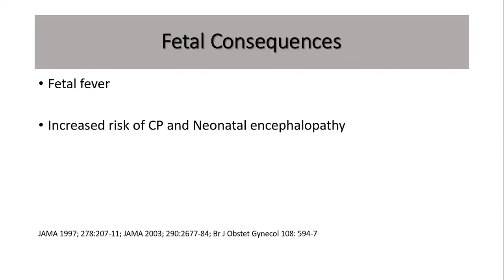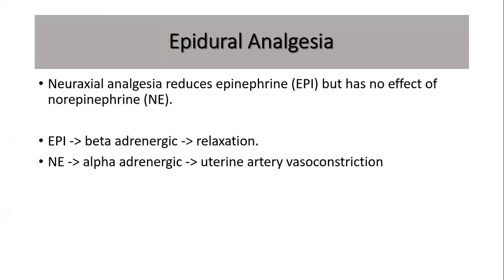Again, fetal fever is directly responsible, because we know that fetal fever is associated with cerebral palsy because of the effects of the fever itself, not even the sepsis or chorioamnionitis related to the fever. So when there is fever, we need to respond with IV paracetamol to try and reduce it. So this is another non-hypoxic pathway of injury, and therefore fever can cause a rise in baseline on the CTG.